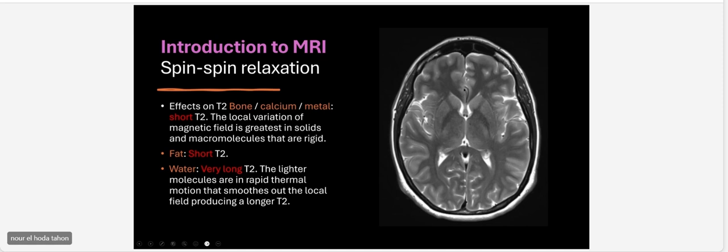Vessels. Yes, exactly. The blood in the vessels is moving very, very fast, so it doesn't catch the signal in the T2. You can see it as what we call a flow void, and this is normal. So when you see a flow void vessel, this is normal.